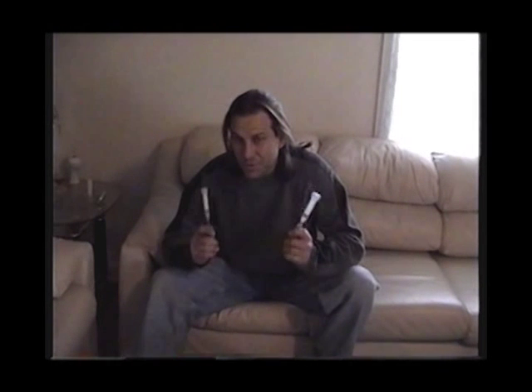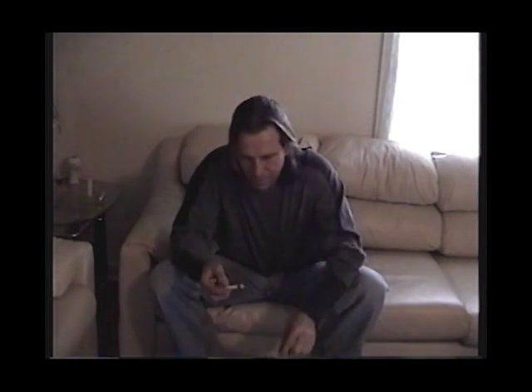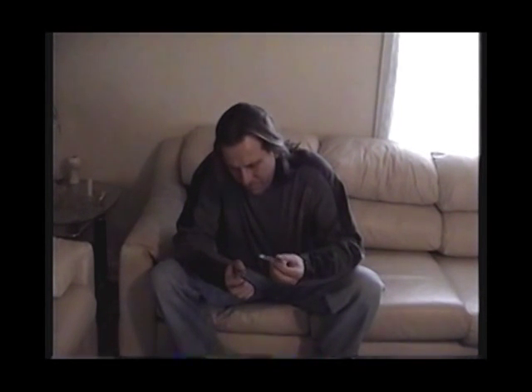Or you can take two needles that cost you 11 cents each — use one to collect, pull out your trusty lighter, take the needle off, pull the plunger out. Have yourself a test tube.